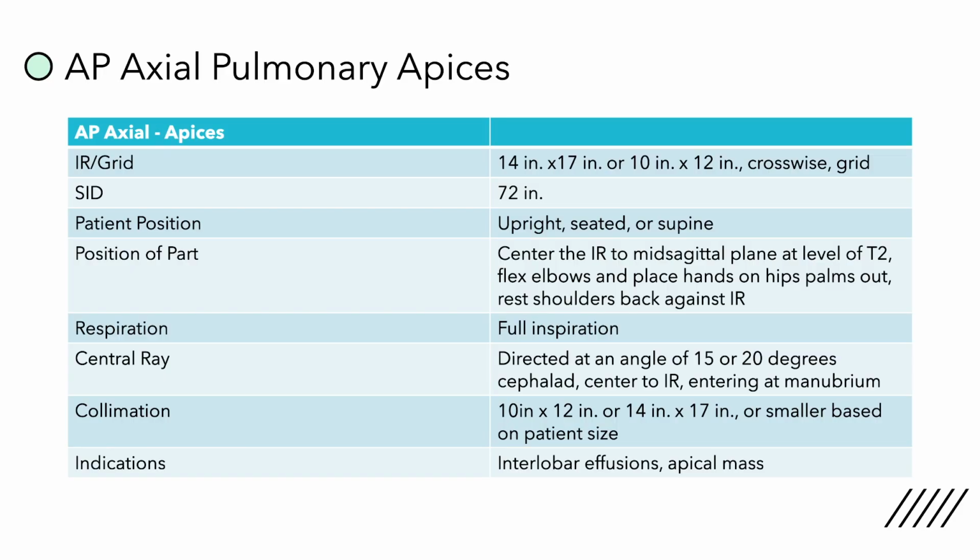So when you're doing your competencies, you don't have to do that. But just note that if you work in practices where they have a machine that's not digital, which is pretty rare nowadays unless you're working in a small place, you will have to move the tube a little forward depending on how severe the tube tilt is.